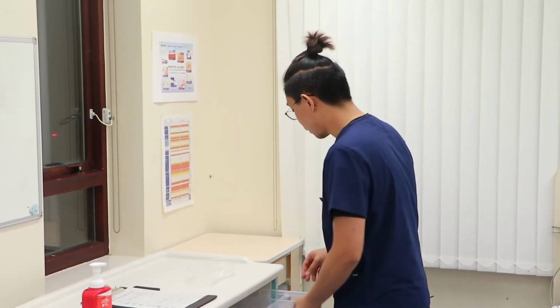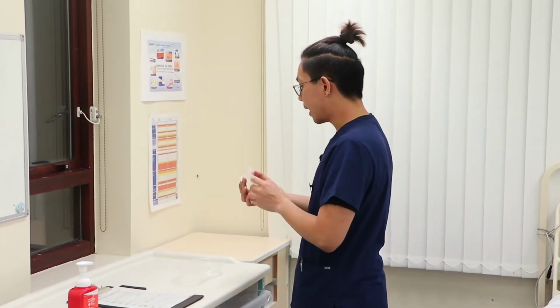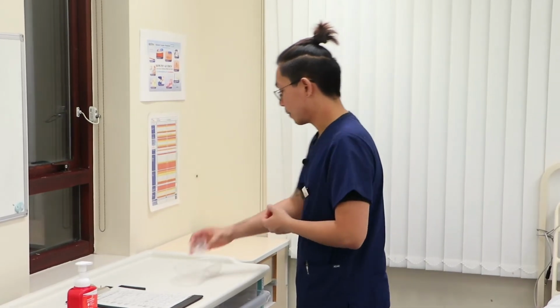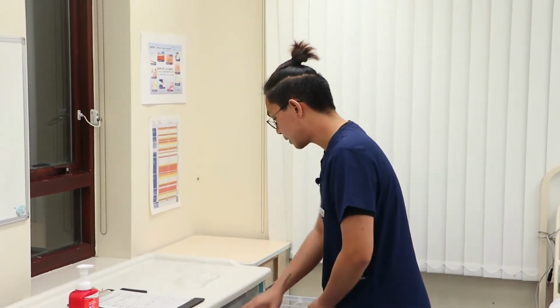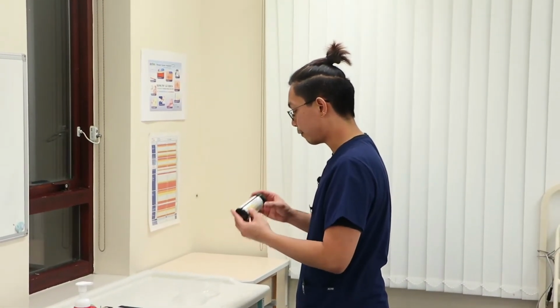Okay, so I'm also going to use a specimen pot, making sure it is clean, dry, intact, and from a box that is not yet expired. So, assessor, is this safe for me to use? Clean and safe to use. And lastly, my multi-sticks bottle, making sure it is clean, dry, intact, and not past expiry date of 2022.